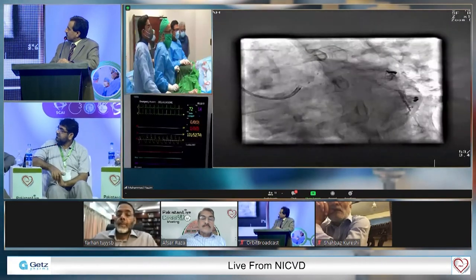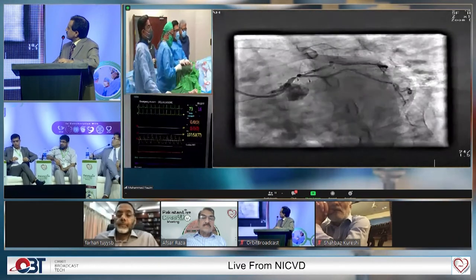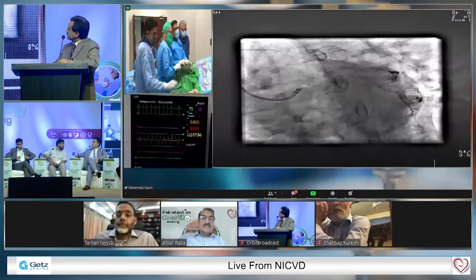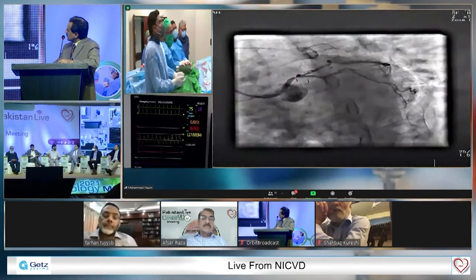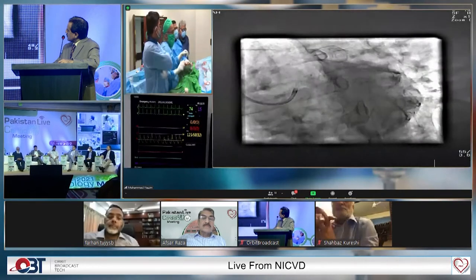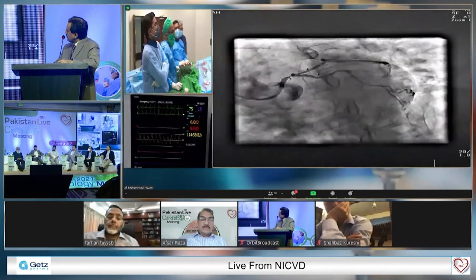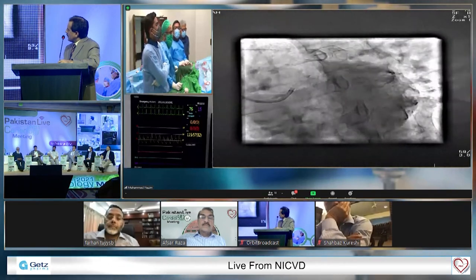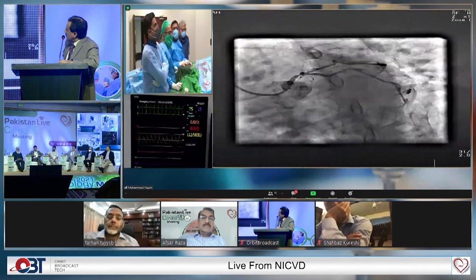So, Javed, you tell us what your plan was and what wire you used and why. Our plan was initially to balloon this tight region and then do an IVUS to see whether the circumflex ostium is healthy, and we were definitely planning after looking at the circumflex ostium. We did IVUS of both vessels, LAD and circumflex.